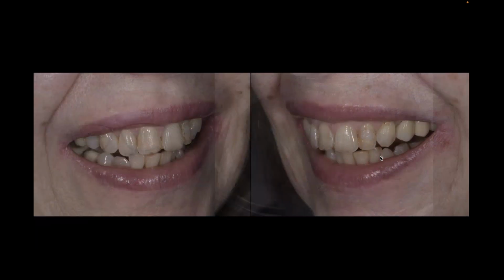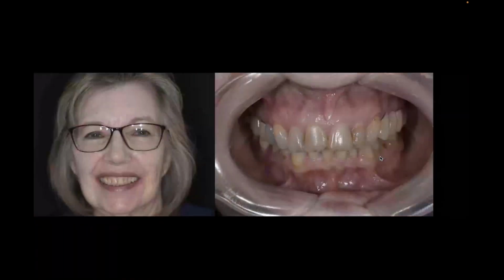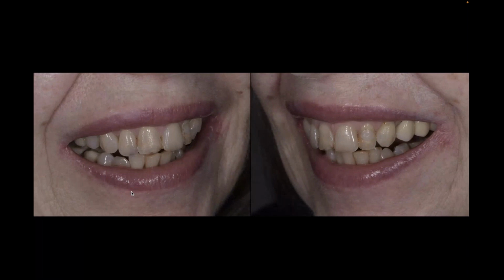She just wanted some prettier teeth, as she kind of said. So we started with the upper arch, and we went through the sequence of what we wanted to do and how we wanted to treat it. But I do want you to notice in her face that even though her teeth look a little old and a little discolored, they kind of work in her face. That incisal edge position works. They kind of work, and even the rotations kind of work a little bit in her face. So this is where we started.